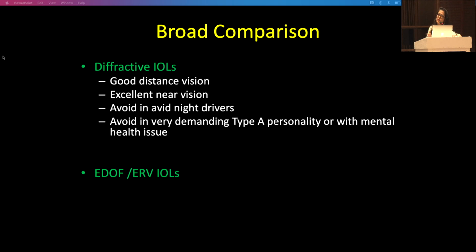So if your patient wants crisp, good distance vision and excellent near vision, the diffractive IOLs, the patient is able to hold objects pretty close also, and in good light they do extremely well. I would choose a diffractive lens.